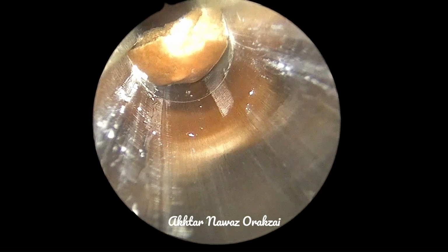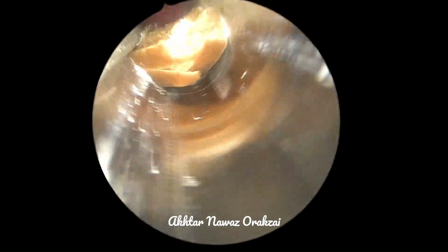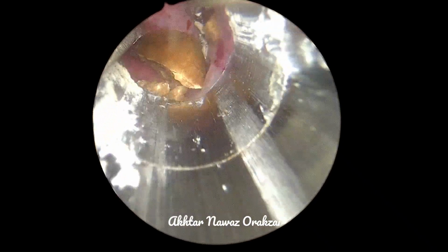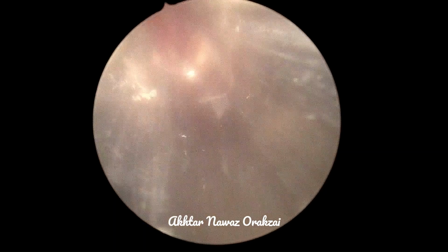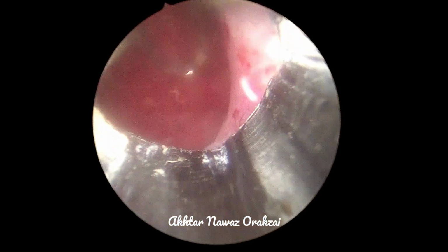and always the mucosa posterior to the bladder stone needs to be in the vision. You can see in the vision that we have taken a little bit of mucosa here.